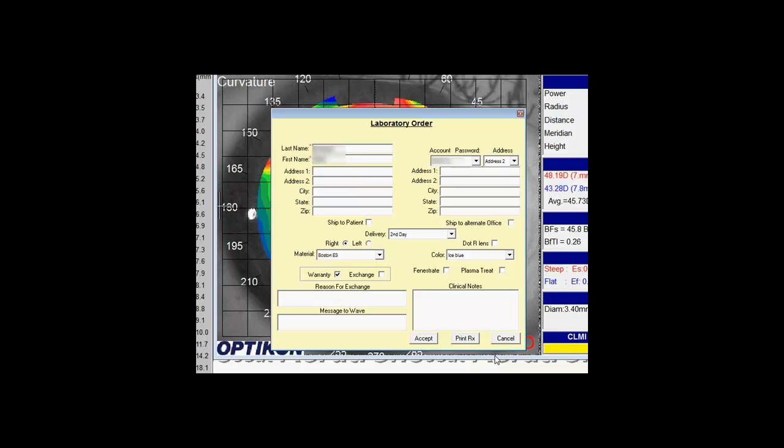finish. I'm not going to run through chapters on each step. We'll just show you when you put it all together really how simple this is. And keep in mind, if you have not gone through the initial training yet, some of these concepts may just seem a little confusing, but once you go through the training and more things are explained in detail, like axial versus tangential, or what the OZ really does on the contact lens, this will make a lot more sense, and you'll see you can really design lenses in just a matter of minutes.